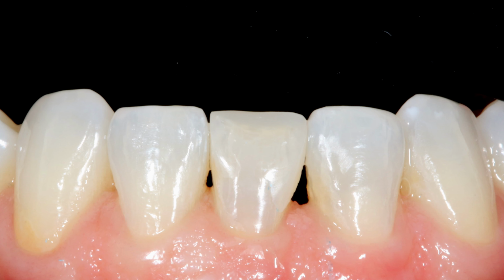What really strikes me about this picture is that even though the interproximal shape, the emergence profile, is radically different on both sides, both sides came out exact. An exact match. In my opinion, this was easier for me to do well, if that makes sense. Sure. Anybody can put composite there and then go back and shape it and trim it and eventually get where you're going, but this made it simpler and a better workflow for me.